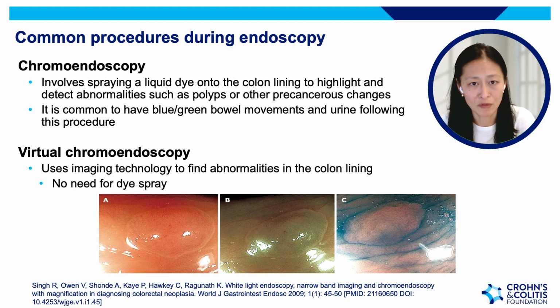For virtual chromoendoscopy, the doctor is actually going to use imaging technology and filters on their colonoscopy scope to find abnormalities in the colon lining. So there's no need for that dye spray, so you wouldn't be seeing the changes in color in the bowel movements or urine afterwards.